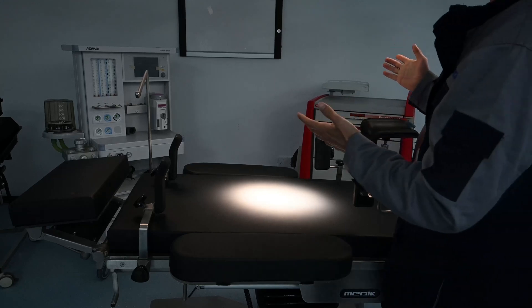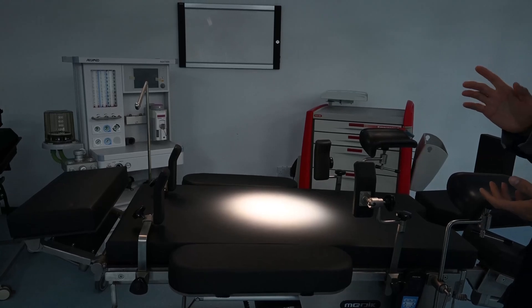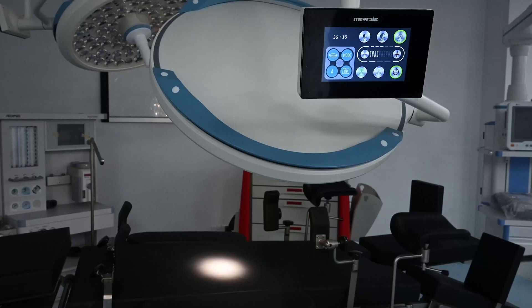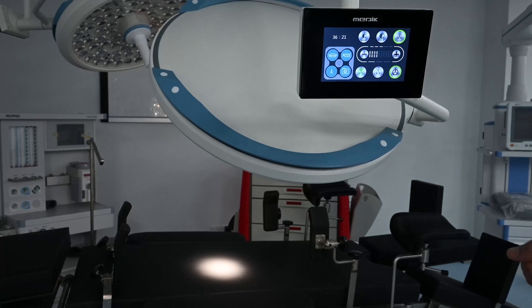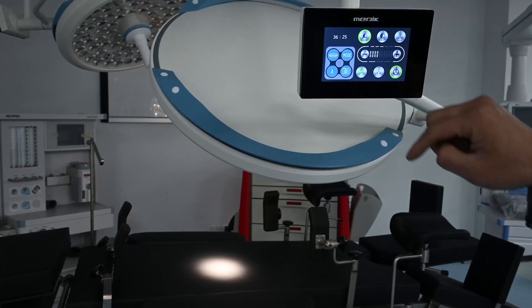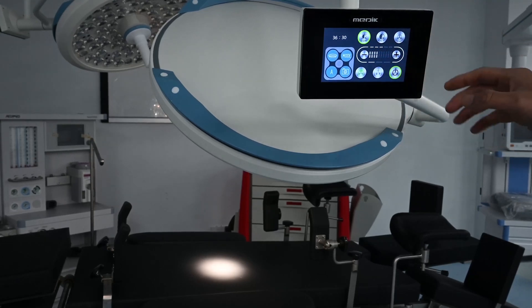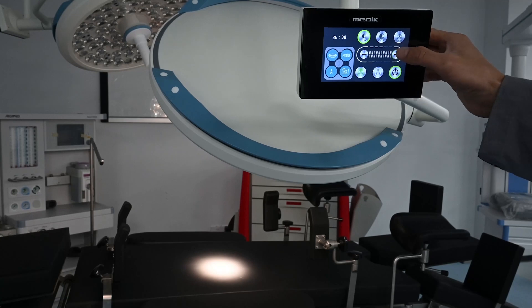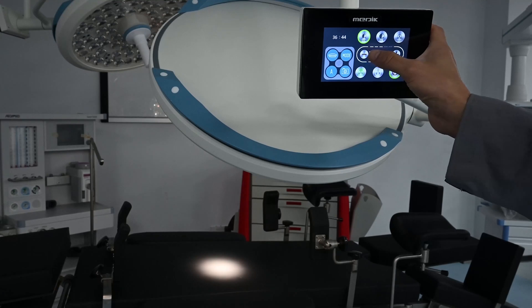This light has an adjustable range from 0 to 160,000 lux. All parameters are adjusted from the touchscreen. We press the lux button and the icon turns green, indicating it is active. Then pressing plus increases the lux, and pressing minus makes the light weaker.